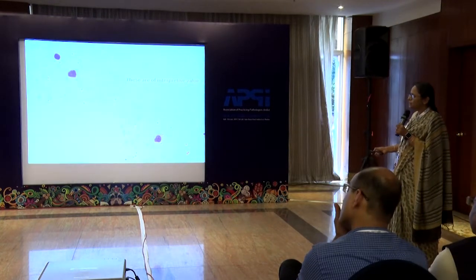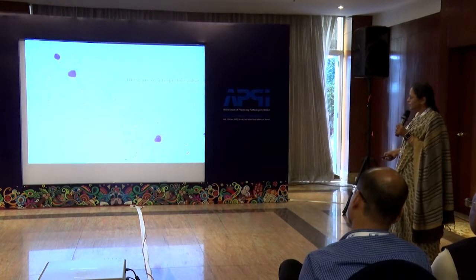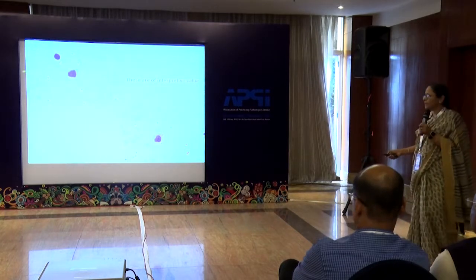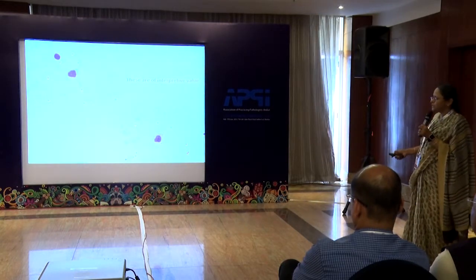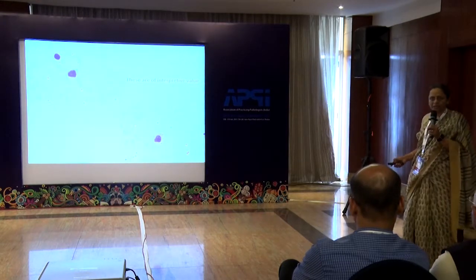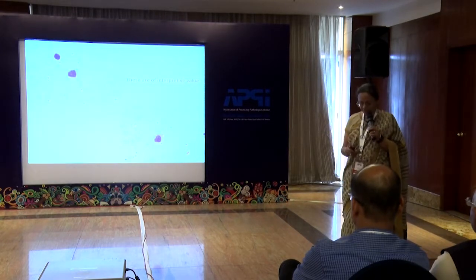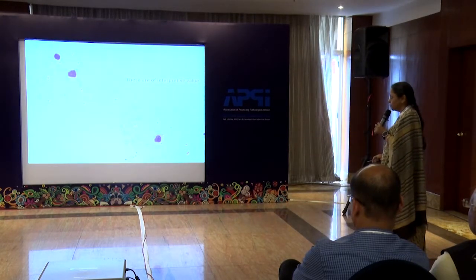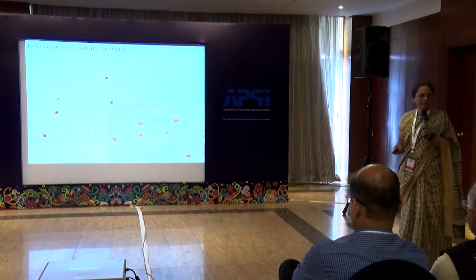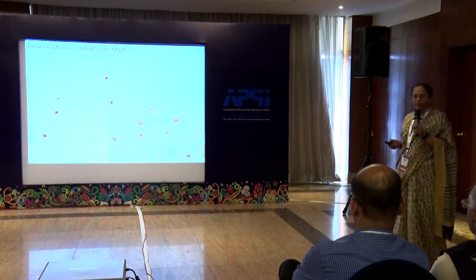And look at the range of these, from the same smear. This is a normal lymphocyte, and this is the range of lymphocyte morphology. If you see frequent lymphoid cells, some looking blastoid, some looking monocytoid, some looking plasmacytoid, it probably is a viral infection, virocytes or transformed lymphocytes. So we saw some examples of diagnostic morphology with leukopenia.